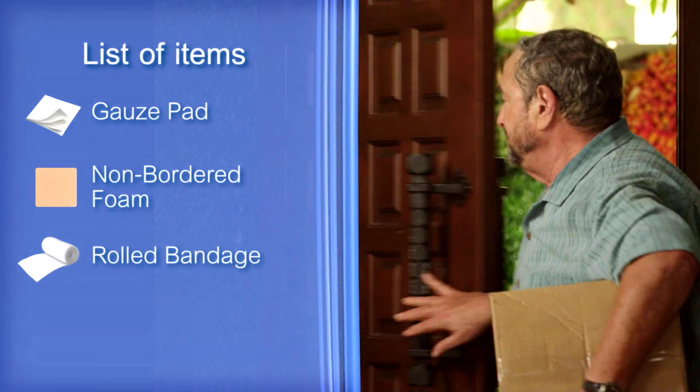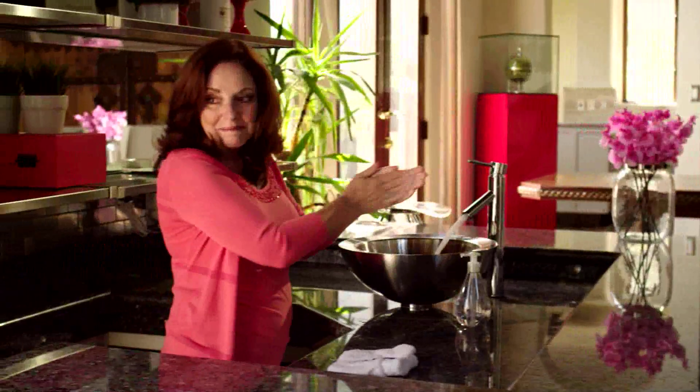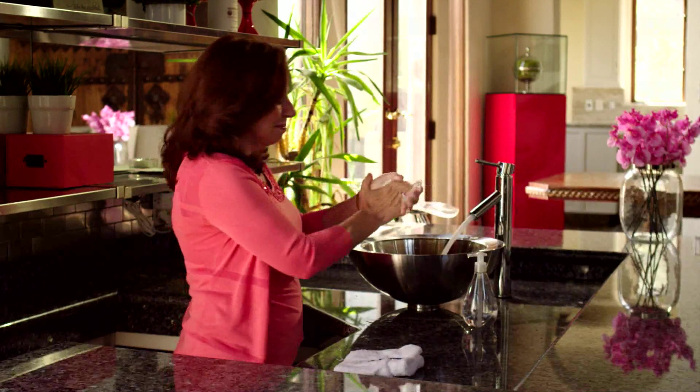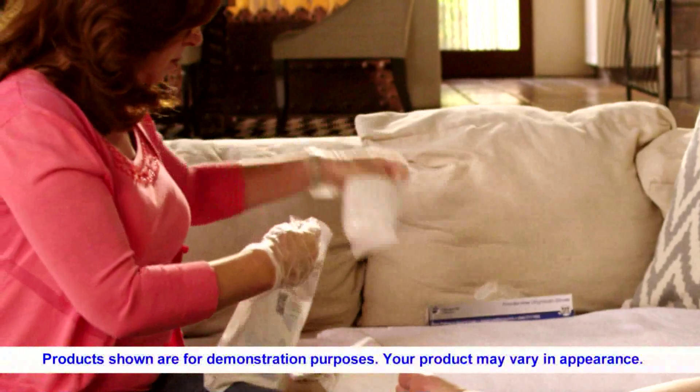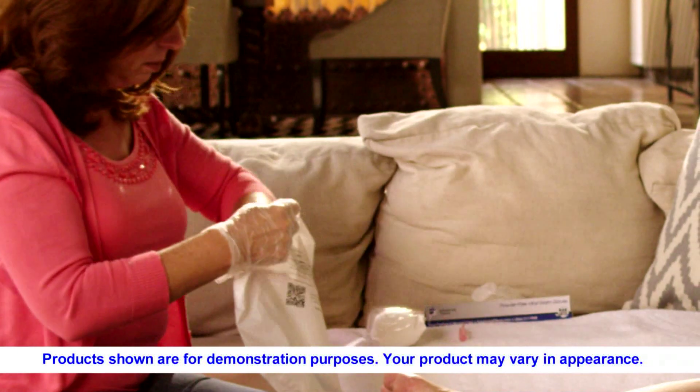Your package contains the dressing your physician ordered for you. Always wash your hands before applying your dressing. Lay out the supplies from your SmartPak on a clean towel, and put on the gloves provided.